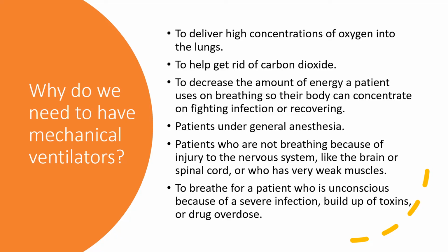So why do we need mechanical ventilators? Why is that a very important tool to have in the ICU? There are many different conditions, so I'm going to go over a couple where mechanical ventilation is really important. Suppose someone has some kind of pulmonary disorder like pneumonia or sarcoidosis or some other form of lung disease, and as a result, they can't get adequate oxygen into their lung.